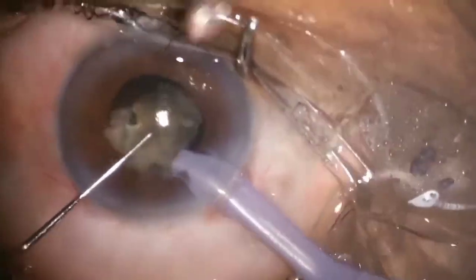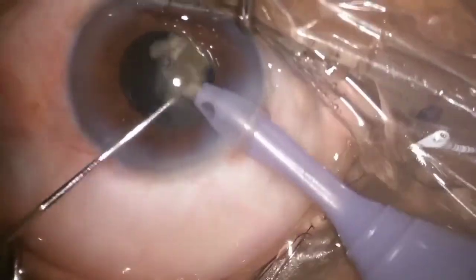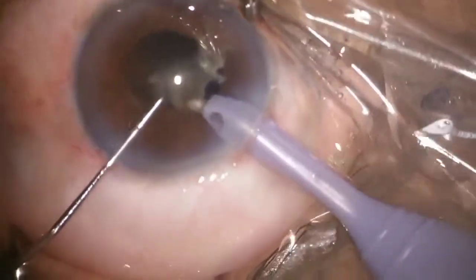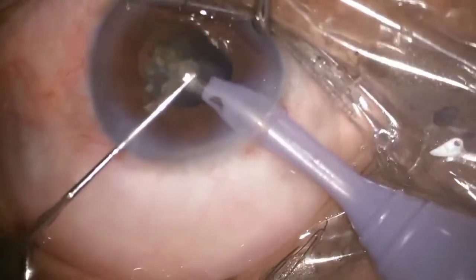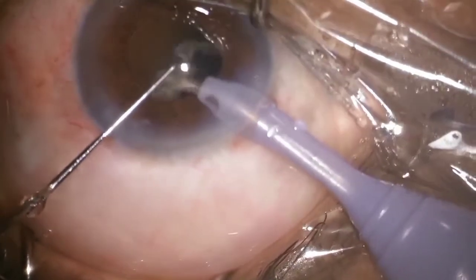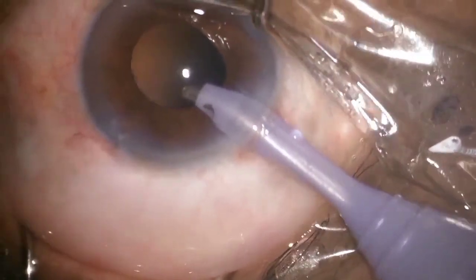But very slowly, I was emulsifying it, and a ray of hope came when I saw the PC, the intact PC with no zonular dialysis. And on emulsifying the last piece, I came in the epinuclear mode where my power was very less. I should have increased it, but I reduced my power to around 20 with a vacuum of around 310. And somehow the Phaco was over.